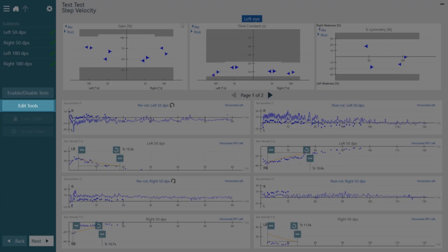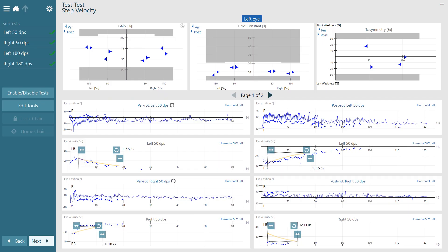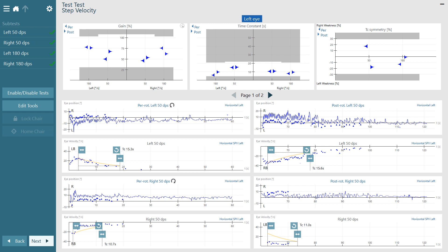Edits can be made to the nystagmus recorded using the edits tools tab, and the time constant for each condition can also be adjusted by moving the slider. This is to suit the needs of different clinics and different normative data.